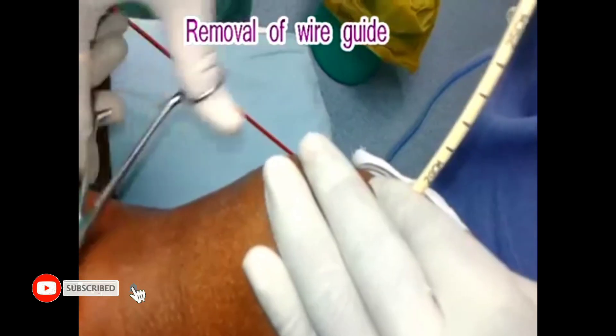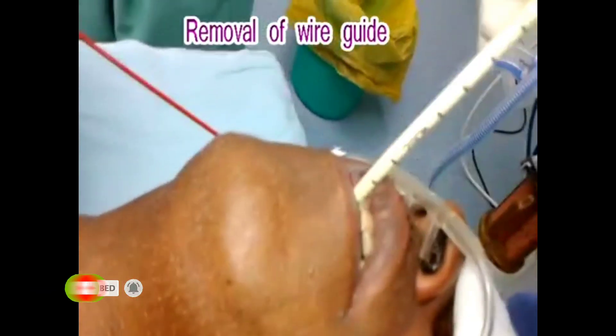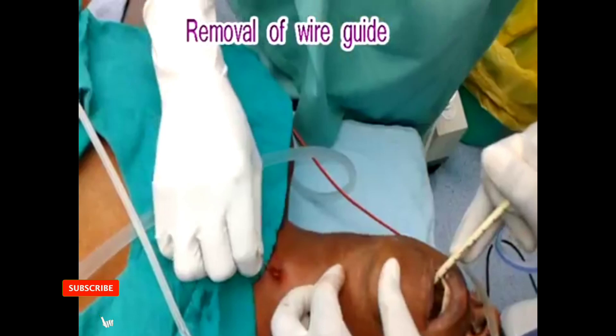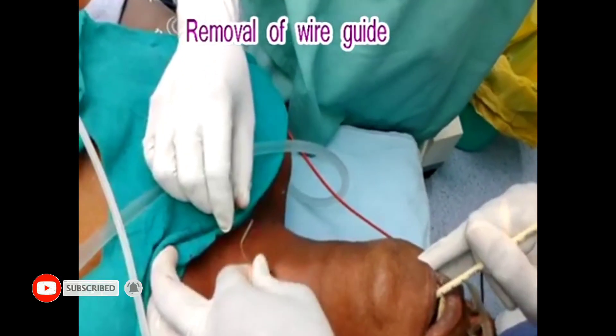As the tip of the catheter guide reaches the lower airway, it will induce a cough. At this point, the guide wire will be removed and the catheter guide will be stabilized, and the ET tube is railroaded over it.